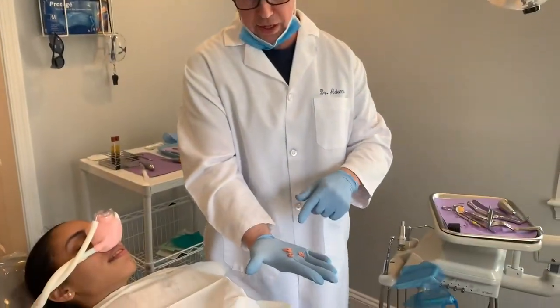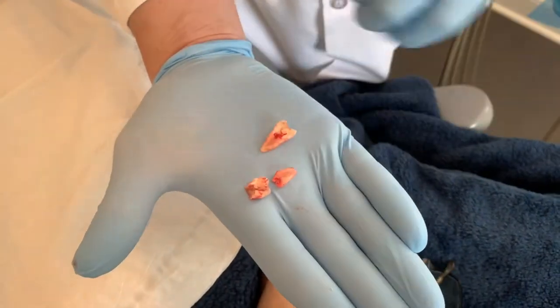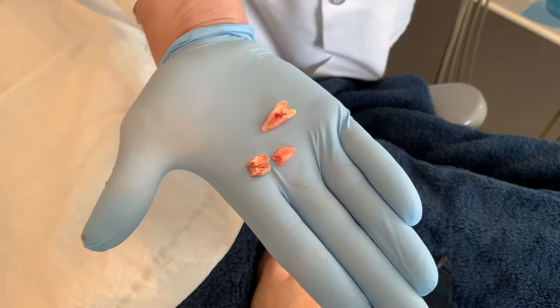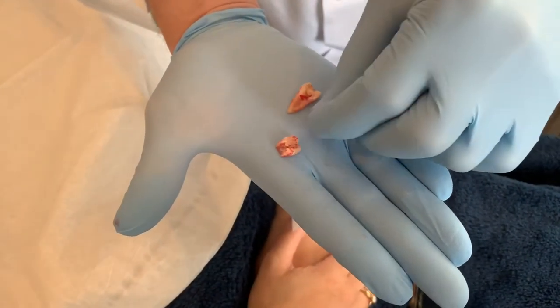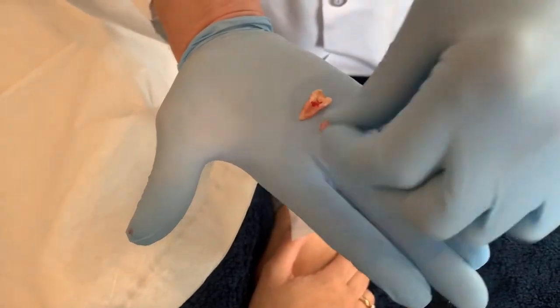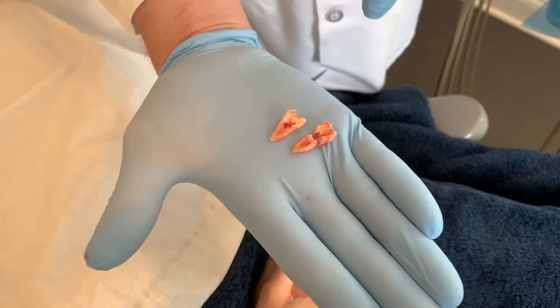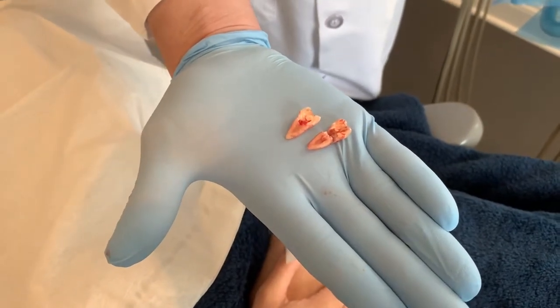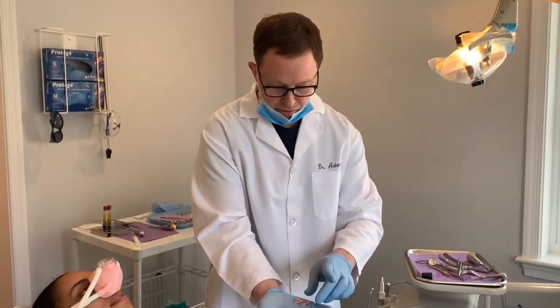At this point, we've actually gotten the tooth out. As you can see, this root came out very cleanly in one piece. We did a really good job of separating it right down the middle. This is the actual other root. And in the process of the extraction, the crown separated from the root. But I think, needless to say, it was pretty smooth. I think it took us maybe 3 or 4 minutes to get this tooth out.